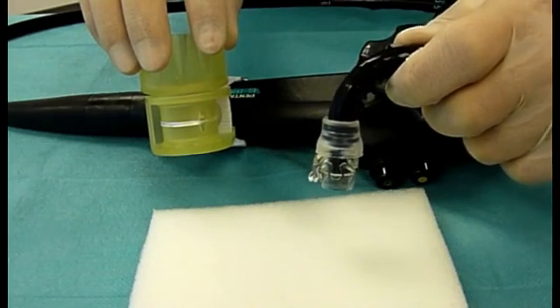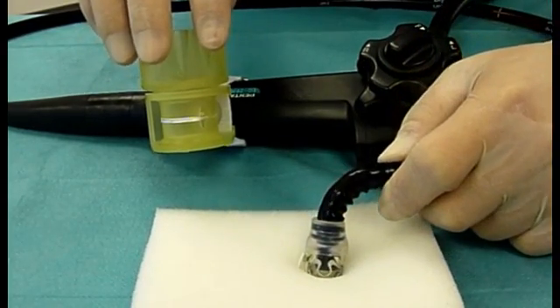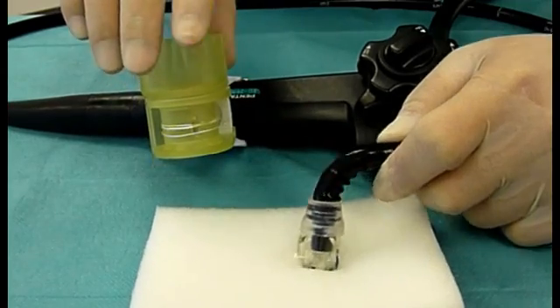The OTSC clip is released from the distal end of the endoscope towards the tissue by turning the handwheel clockwise.